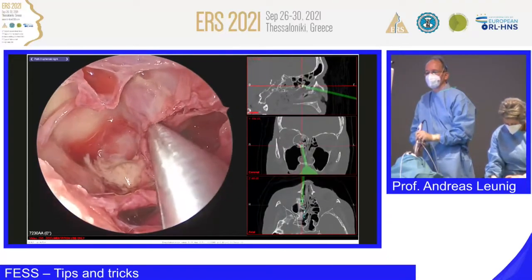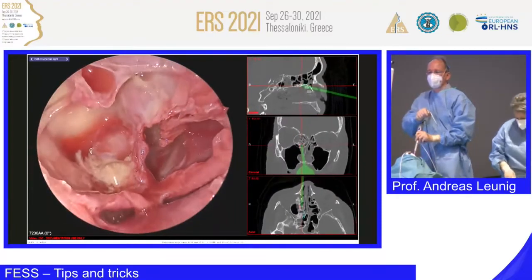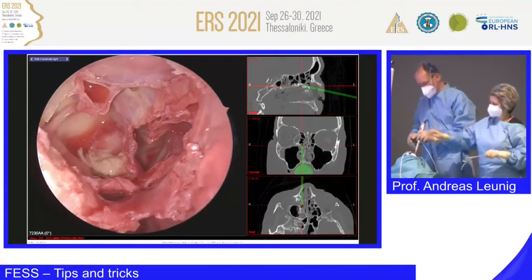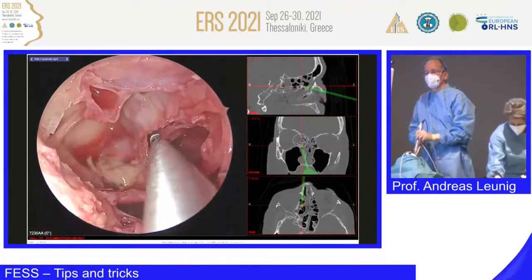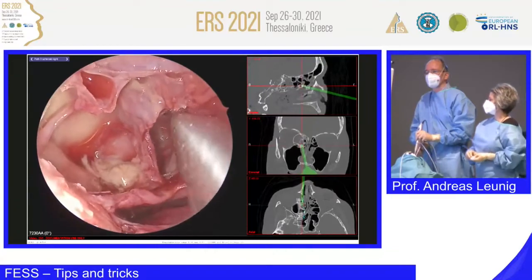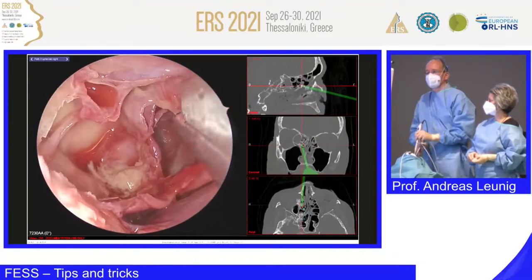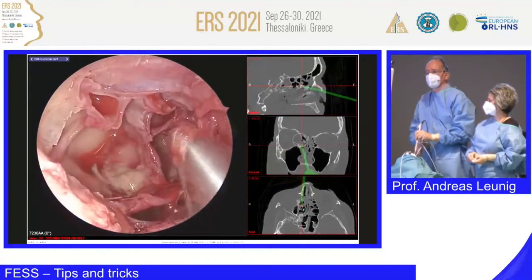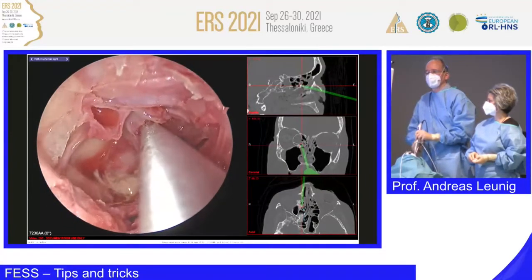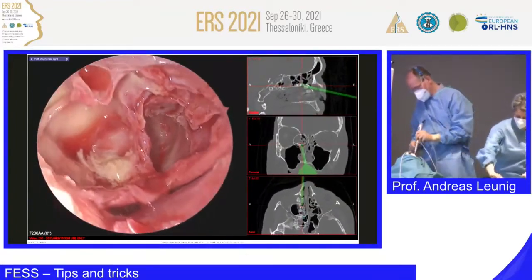Okay, so when you go into the sphenoid sinus, always go medially and inferiorly. That's the safest way. Here, once again please, the big elegant punch. Okay, so we're going here, taking this away. There are some bony lamellas up there. There are some cells up there. Can remove these. Now coming more from back to front. I try not tearing out too much of the mucosa. So, sucker.